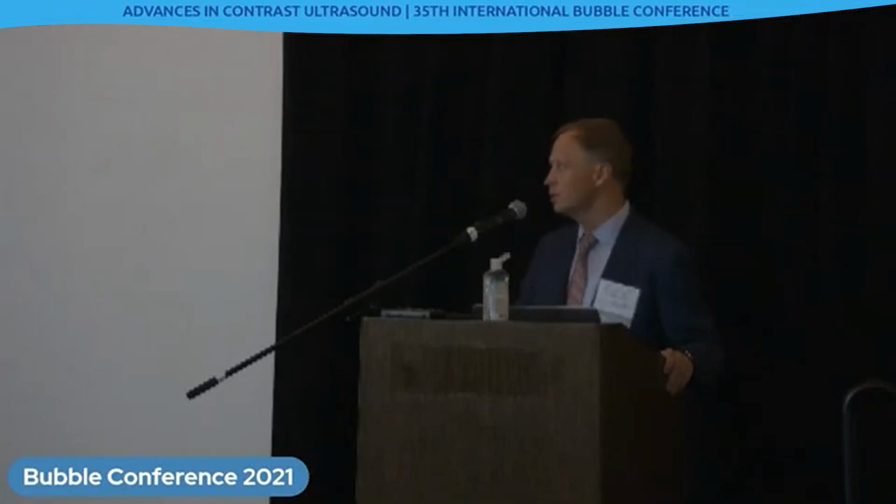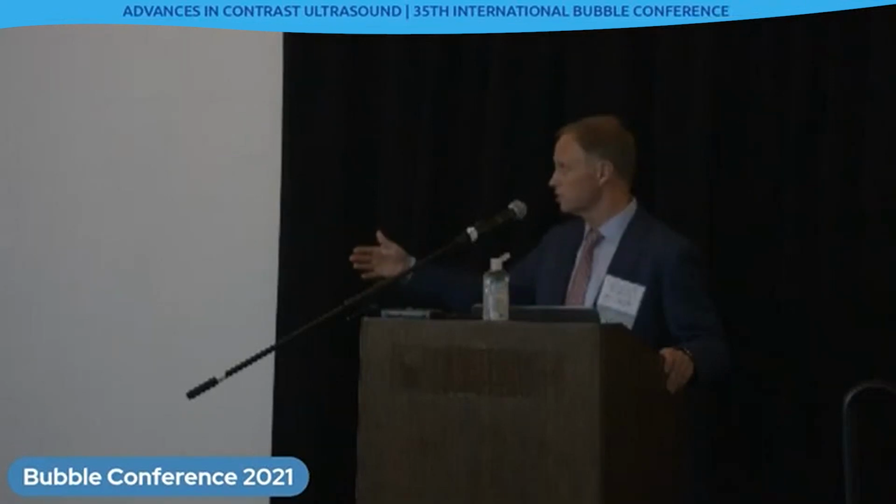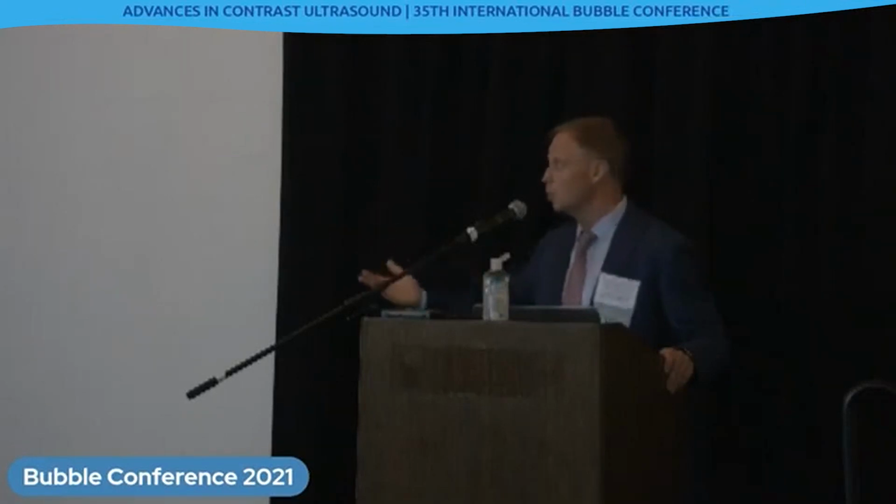Same with CT and MR. So we are very, very aligned with CT and MR. CT and MR also cannot tell 3s and 4s from HCCs, because it's a process. I don't know if pathologists can, because it goes from dysplastic nodule to progressed HCC. We don't know how to tell them apart. So until we get enough diagnostic confidence that this is HCC, we would not call it that.